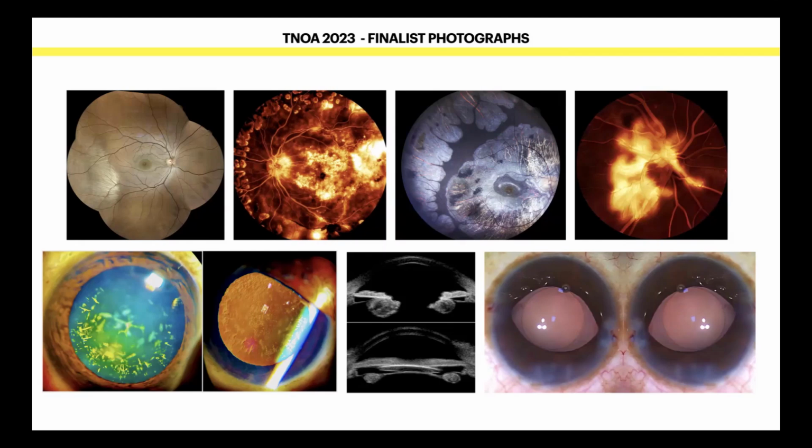And here, I want to show you guys this one particular surgical image of mine. In this case, I was very happy because I got a very circular capsulorhexis. This was one of my earlier days, 2019, when I was just starting my practice at Trichy. But ironically, my two side ports were a bit weak. So both the irises were going on either side of the side port, and it was giving an eye within an eye feeling, right? So I just stopped, documented it, and then went back to putting the iris in and then placing the IOL. So always documentation is the key.